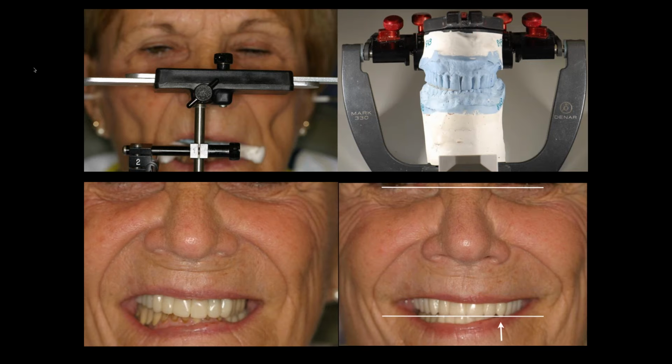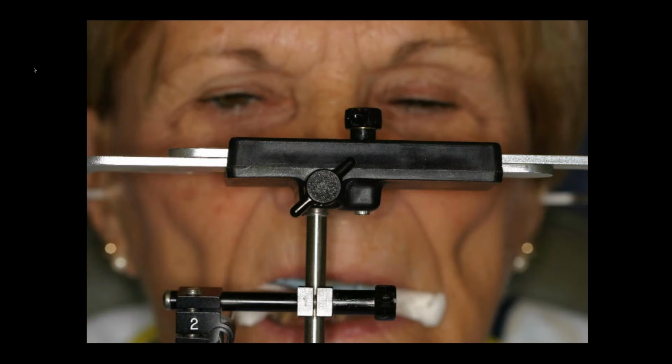This is where she started, still better. But what happened? So I went back to these original pictures, and the first thing I did was go, well, actually, I think her pupil is probably up there behind that eyelid, but can I really use that? I really can't verify with this picture. So what about, I'll use that fold. That probably is symmetrical from side to side. So let's call that the horizontal axis. And if we look at our face bow, it was wrong, okay? But I had no way to verify that at the time.